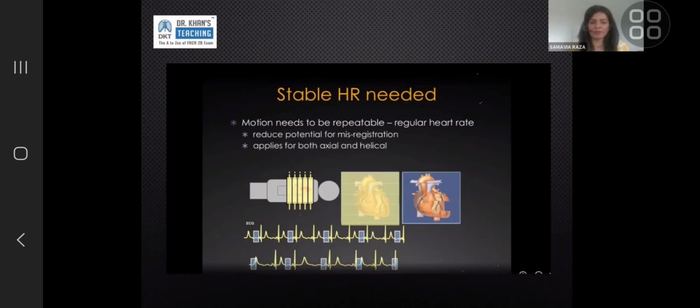What you then are left with is post-processing, and post-processing in cardiac imaging is extremely sophisticated. The scanners and the software are really good in trying to find you the best possible phase, the best possible millisecond, the best possible image, and stitch them together to make a packet for you. Some of that is manual, so that's where your radiographer comes in. Some centers are in-person supervised, so the radiologist does that as well. Certainly, as a trainee in cardiac imaging, you should be doing that, so you know how to fix a scan. No matter how senior you get, if you get stuck, you should be able to fix the scan or the image yourself, or be able to tell what is wrong with the scan.